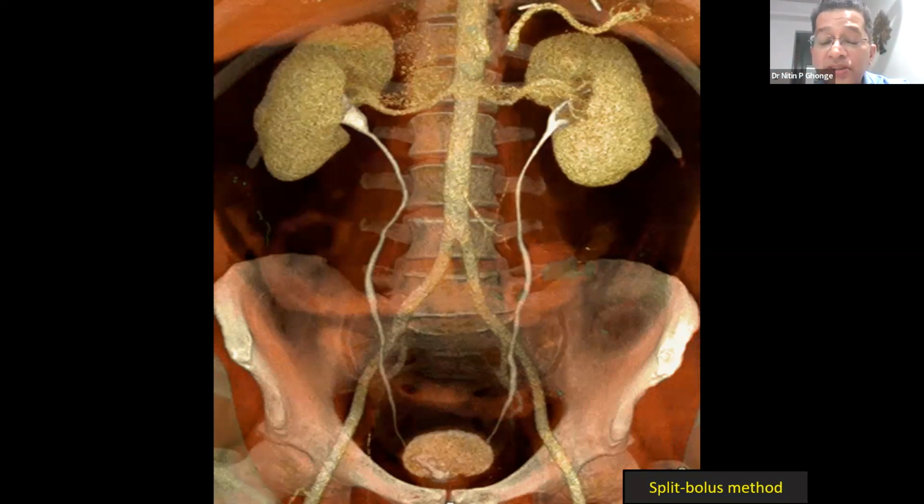Another important thing which, as a nephrologist, you should know is if for some reason contrast cannot be given and you want to evaluate a particular abnormality and only plain CT is to be done, something like renal abscess, pyelonephritis, or abnormality related to the renal parenchyma, then it is always better to advise MRI.